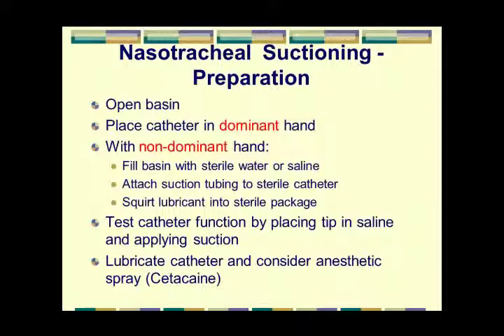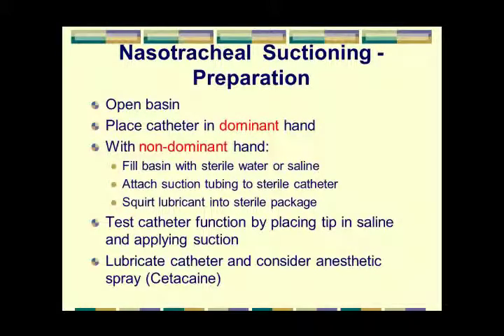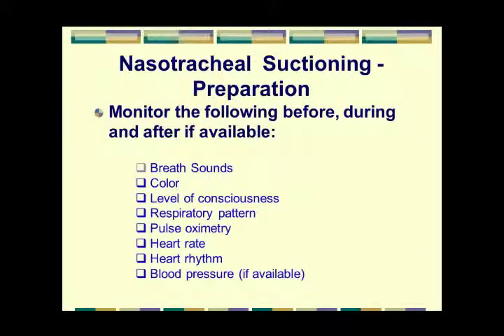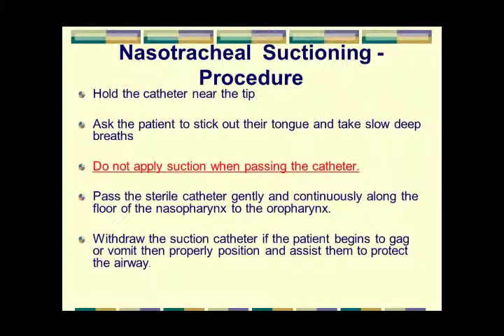Okay, it works fine. Now I'm going to go ahead and be able to lubricate the catheter. Usually what we'll do is take that lubricant and place it in the sterile field. I can just rub it in there and get some on the tip. And then, again, monitoring my patient for respiratory distress in the ways that Mary taught you last semester. Hold the catheter near the tip. Again, you have better control over where that tip goes the closer your hand is to that tip.